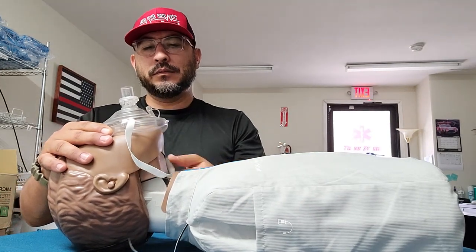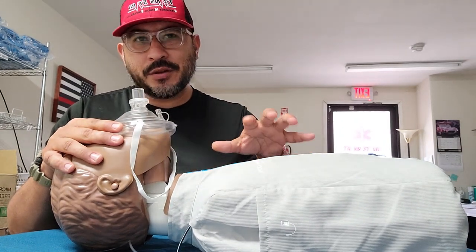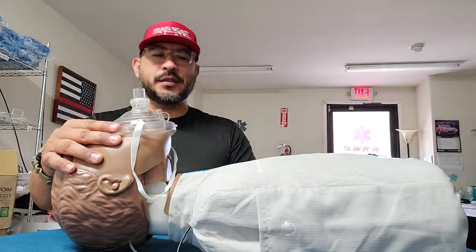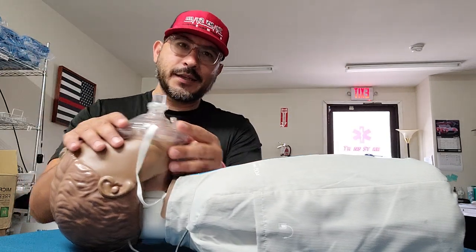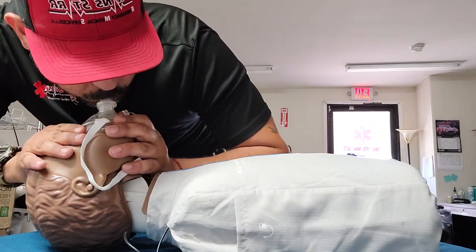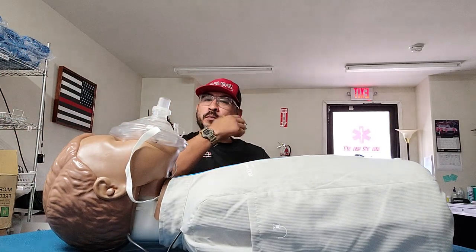You're going to open the airway and give two rescue breaths. Two rescue breaths, then make sure there's adequate chest rise and fall — that way you'll know you're giving the adequate respiration the patient needs. So it's just a head tilt chin lift, and then you're going to be breathing into the patient just like so. That's two rescue breaths, and they go together with the compressions at the 30 to 2 compression ratio.